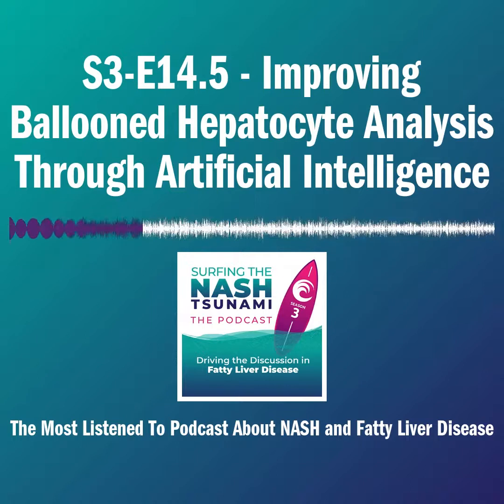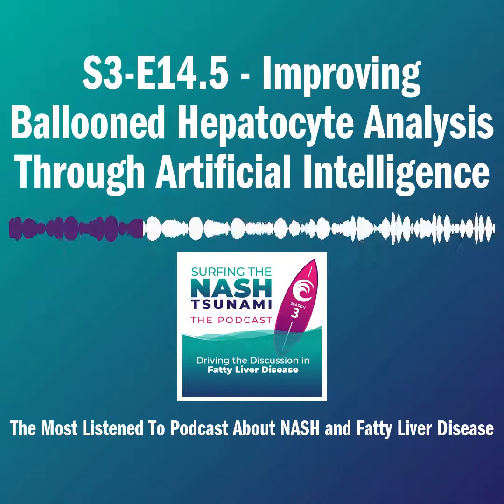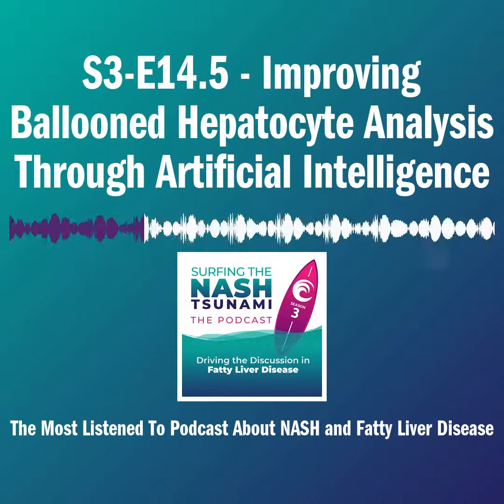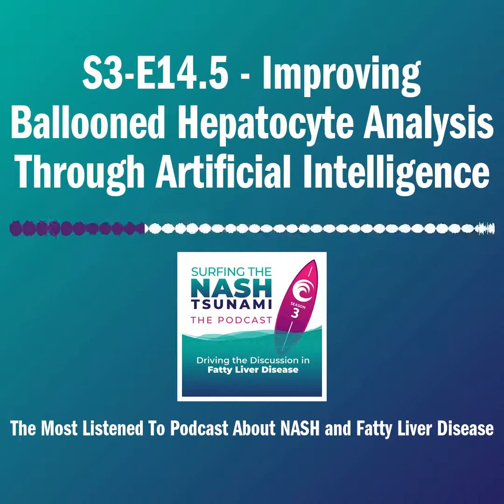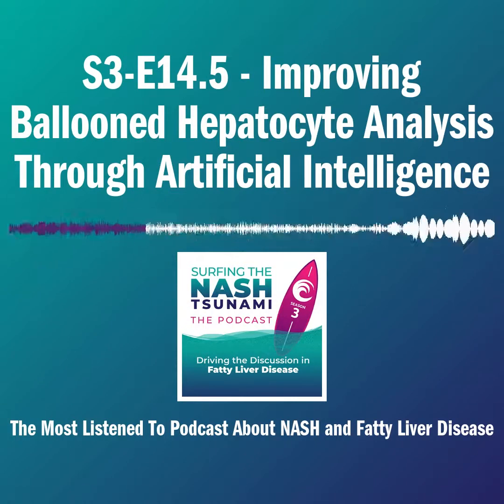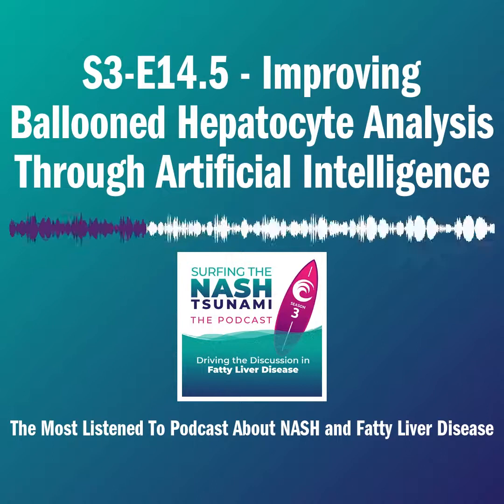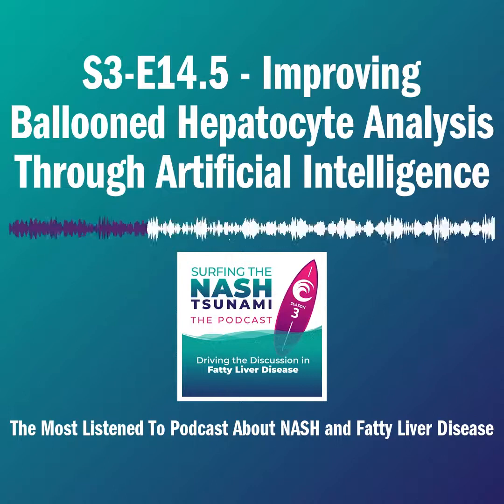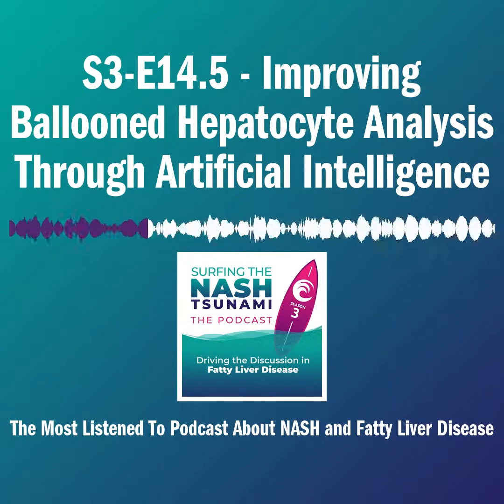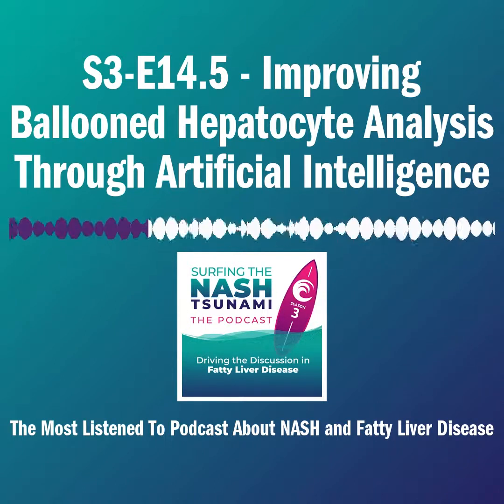And, as we mentioned, scores like SAF that do provide a little bit more definition of what is a balloon cell are potentially helpful in that respect when you compare it to how NAS is scored. Nevertheless, to my mind, because of the subtleties of assimilating all the visual clues to identify a balloon cell, I'm not sure this is just a case of training, because we had a group of very highly trained pathologists here. This is something where we need to provide an additional layer of assistance to really standardize, I would suggest. It'd be interesting to hear what Joern and Mazen think.